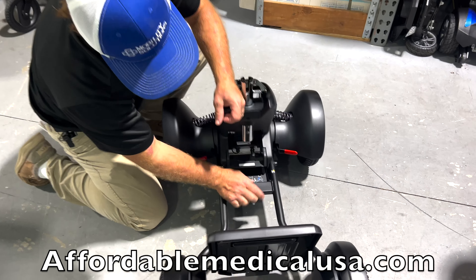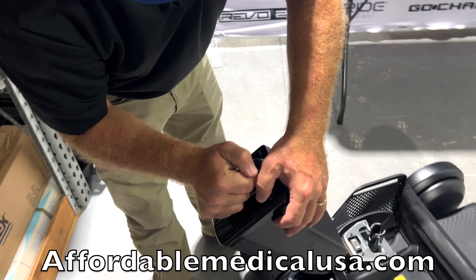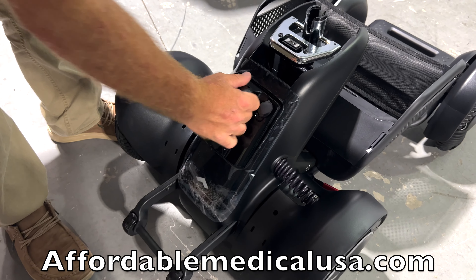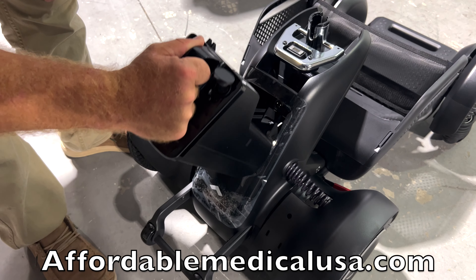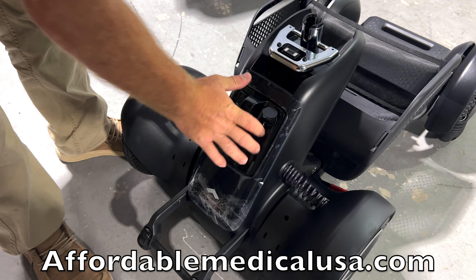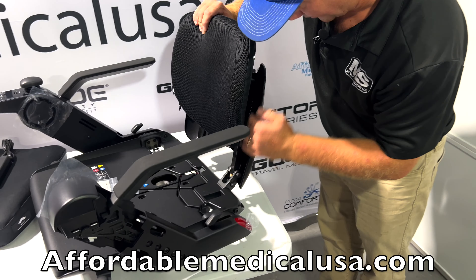Just like that, and then you can drop your basket right on there. You can put the little ties on, or however you want to do it — it should just fit right back into place. Just so you know, the foot plate goes up and down. I don't see many adjustments for that. These are covers on it. Putting the seat on — the battery connections and charging ports are at the top. You take the seat and put it in like this and it clicks. If you do it the wrong way it's not going to work. Click it in. There are some spring shocks back here on the seat. You can also adjust the height of the armrest using the tools that come with it.